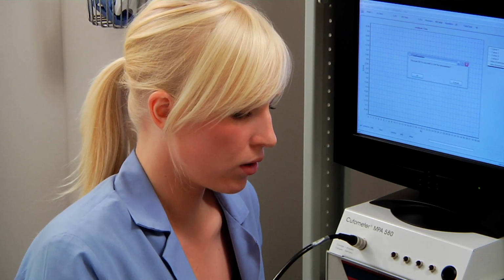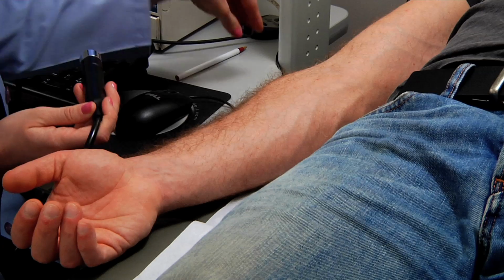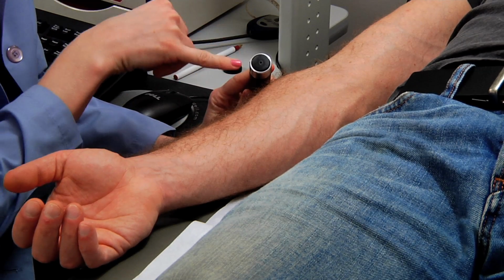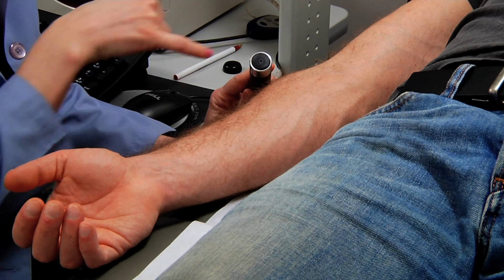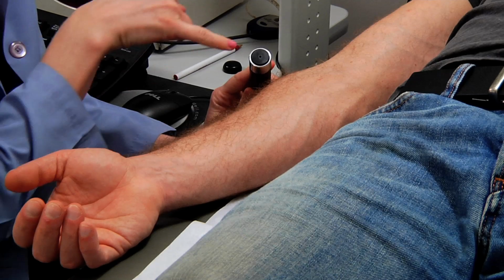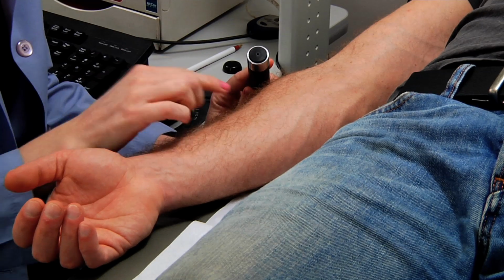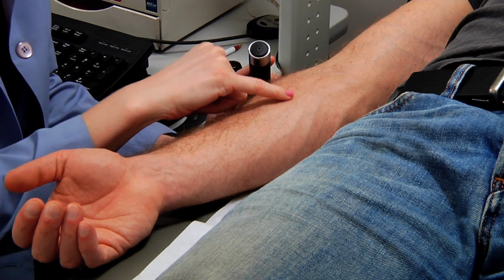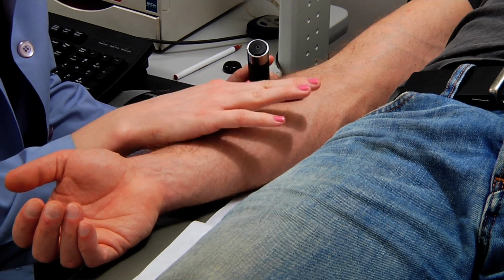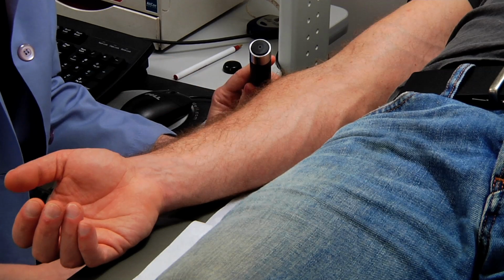So what you do first is you take the lid off of the probe, and you'll see here that there's a hole right in the center of the probe. That's the spot that's going to actually suction up the skin. So you want to make sure that hole is going to be on a spot of the forearm that has no hair, no pen marks, no scars, nothing that would affect the skin elasticity.